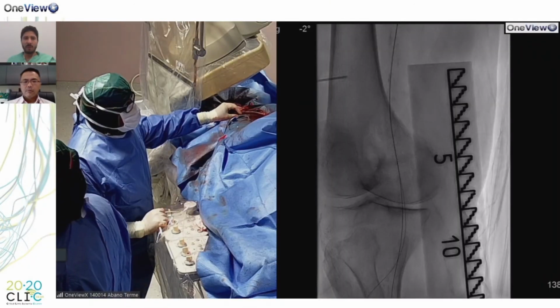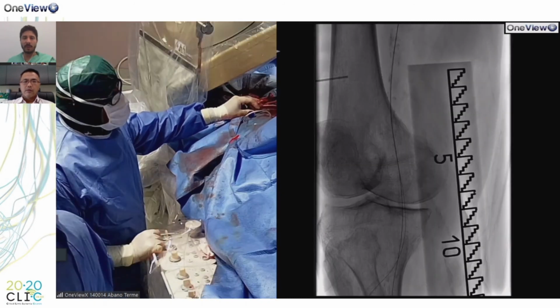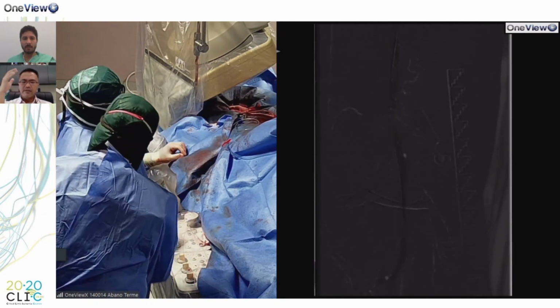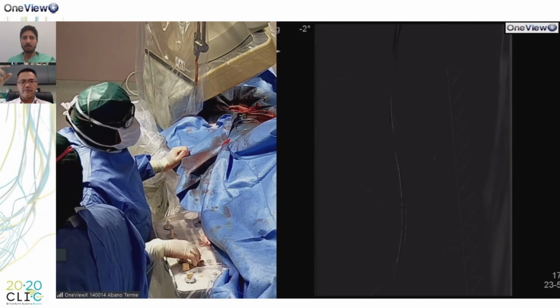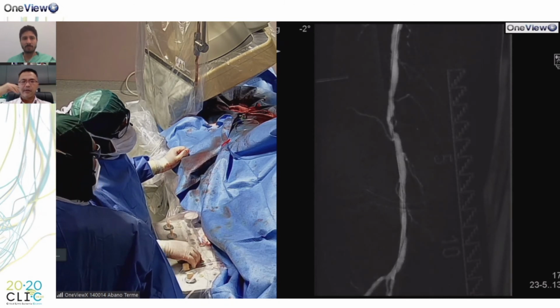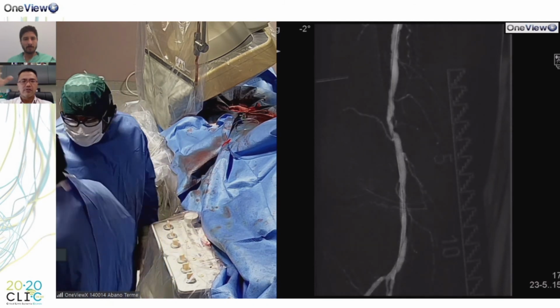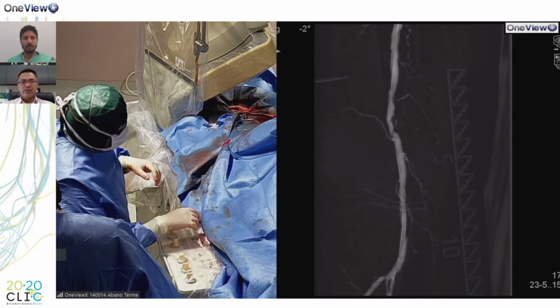Yeah, I fully agree with you, Steven. I think 6 millimeters is a reasonable diameter for the popliteal artery. Based on the IVUS, the disease seems to be more significant than the very short lesion. The whole vessel is calcified. So perhaps the IVUS could help us mark where the most severe portion is, so we get total lesion coverage with the drug-eluting stent.